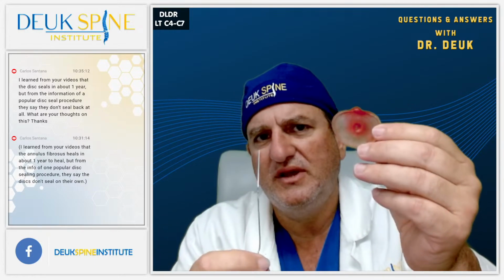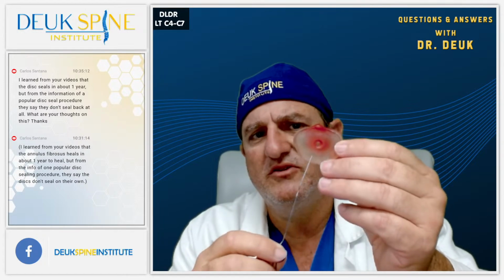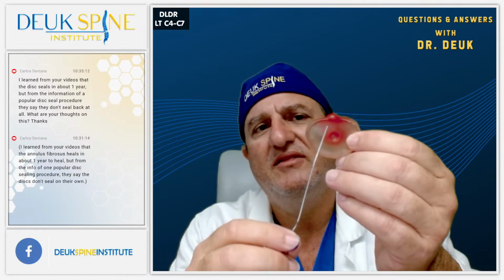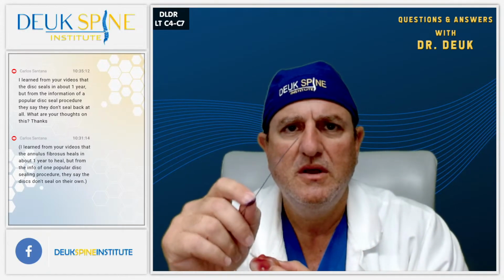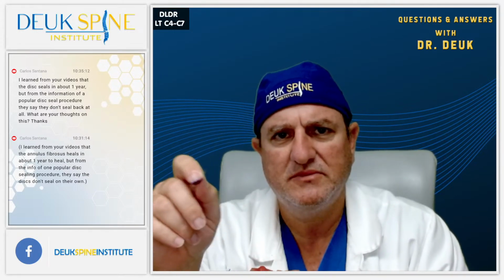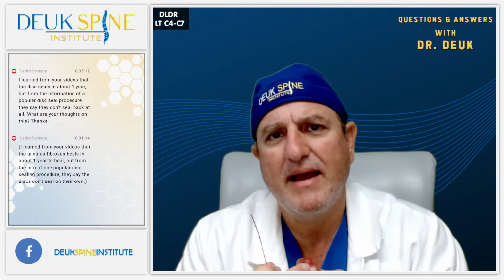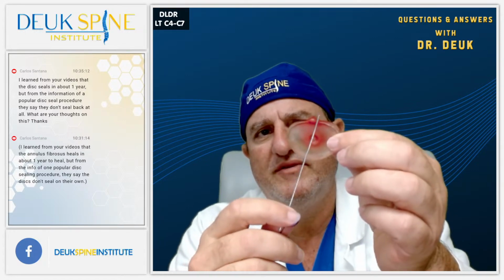So when I said to you the other day, or whenever it was you're listening, I don't take your disc out. We're not removing your disc. We're not taking any of the normal disc out. We're only cleaning the tear, debridement of the tear, which means I'm removing scar tissue, inflammatory tissue, and any bone spurs or calcium deposits in there that are abnormal, and herniated fragments. So those are what we're removing from the tear. Okay, and we also remove anything sticking out in the epidural space or foramen.